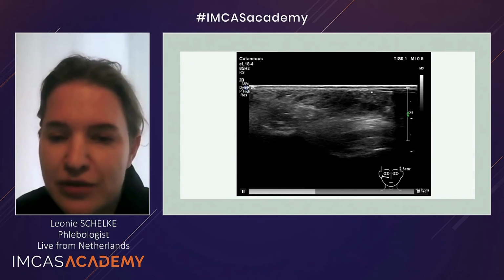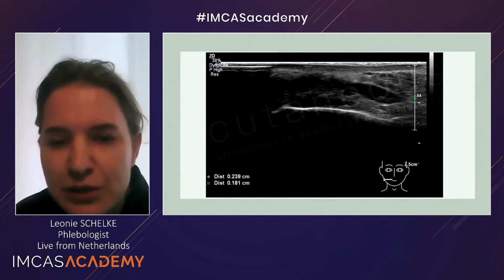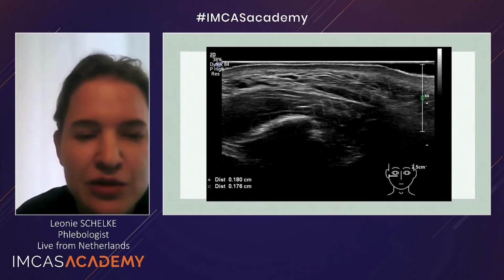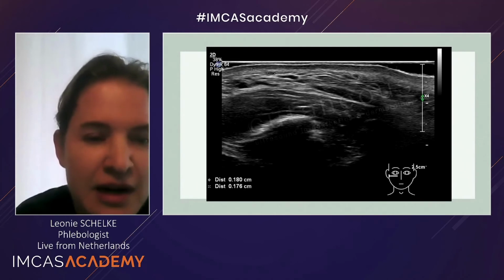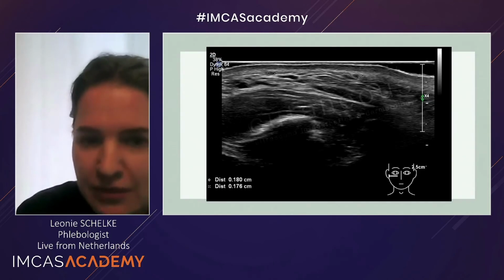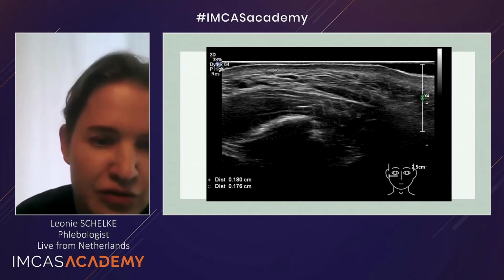And then if we look at the product, here it is injected underneath the dermis. And here, once again, this is the product I injected more into the deeper layer. Oh, I'm lacking time, but let me go back, because here you can see very superficial, but they're too small, injected the hydro. So the hydro max product should be more into the deep subcutaneous tissue.